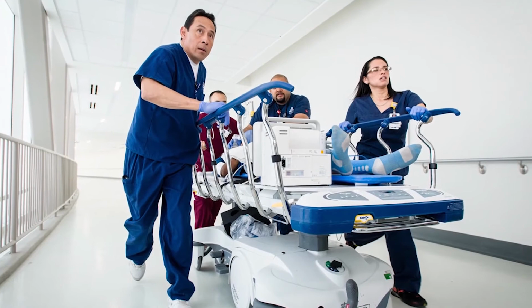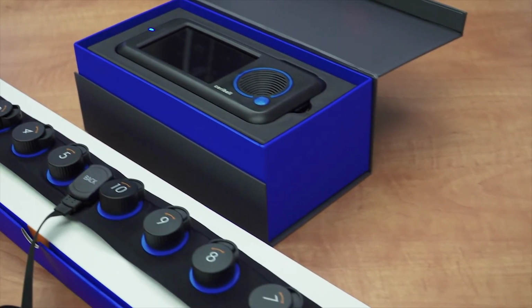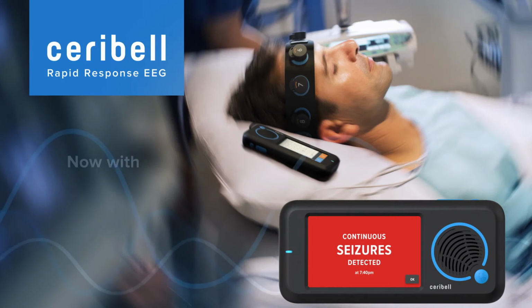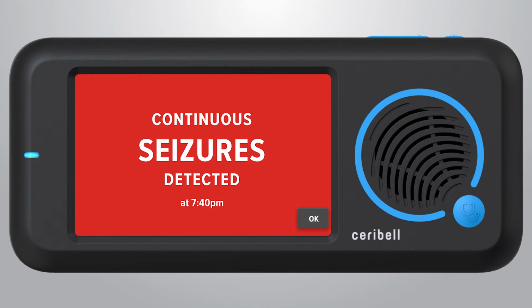When the ability to quickly assess critically ill neurological patients is needed, the Ceribell Rapid Response EEG resolves the challenges of conventional systems by providing an intuitive, one-stop solution for quick and accurate triage of brain activity. Now, with Clarity, Ceribell continuously monitors the EEG in real time and can automatically detect and rule out seizures. Clarity is the only FDA-cleared tool that provides an instantaneous bedside alert when brain activity consistent with status epilepticus is detected, enabling clinicians to intervene quickly when the patient is at risk.